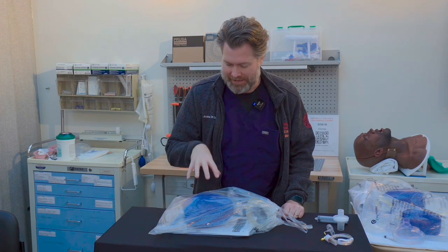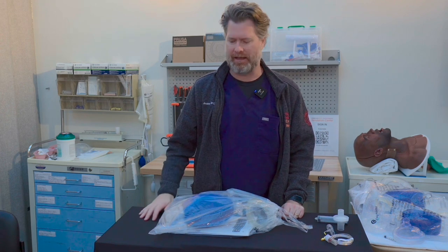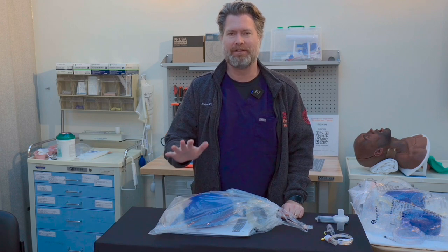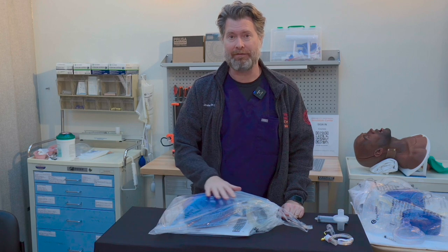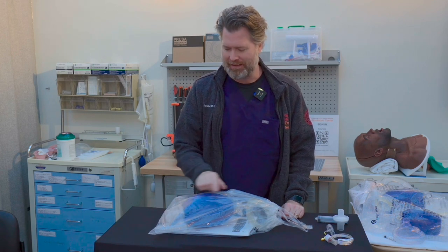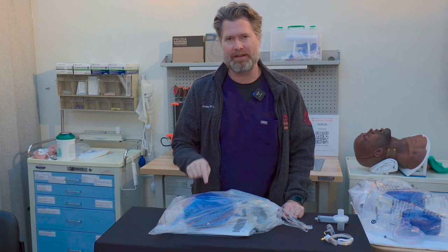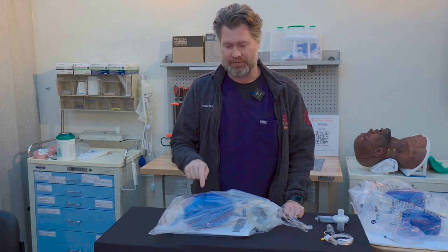Hey everyone, I am Dr. St. George, and today we are going to do a deep dive into the anatomy of the bag valve mask. I think we grab these all the time and use them on patients, but I don't remember the last time I've actually opened up a bag and thoughtfully gone through everything that's in here. So today we're going to dive into this and take a look at all the pieces that go into the design and how it works. Let's get started.